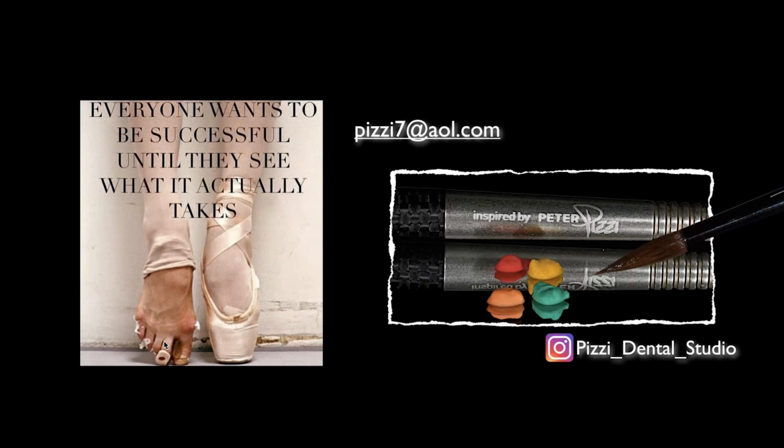But really, my main concern for stones is the expansion factor, right? What we're most concerned with is that we have a stone that expands about 0.09, which is the average shrinkage of impression materials, and then mixed and measured and weighed well. But in almost any cast, if it's poured properly, meaning that you don't over-debubblize and you flow the stone through the right way, you're going to capture and see the surface texture, whether the stone itself is white, yellow, blue, or gray. You'll still see those details.